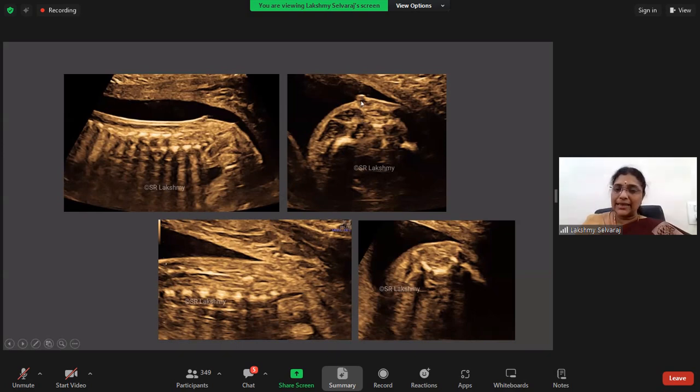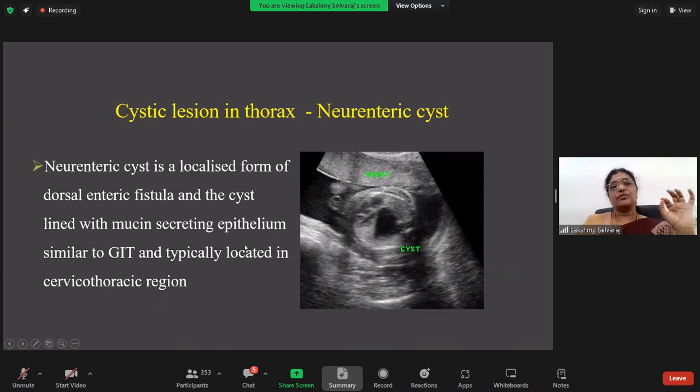It's very subtle, but it is there. There is a subtle protrusion here, and you don't see cord structures, you just see the echogenic elements of the cord all going lower down. And can you see the divergent spinal pedicles? So that shows the importance of looking at the sagittal, axial and coronal planes, and then you get the entire picture.